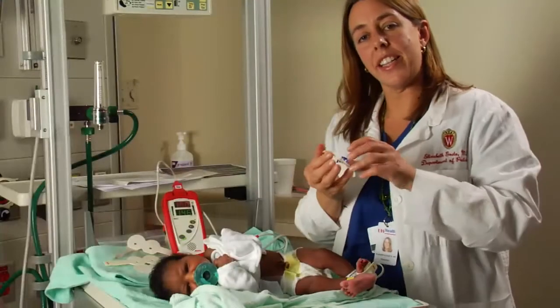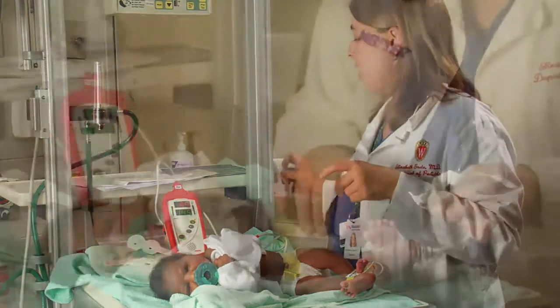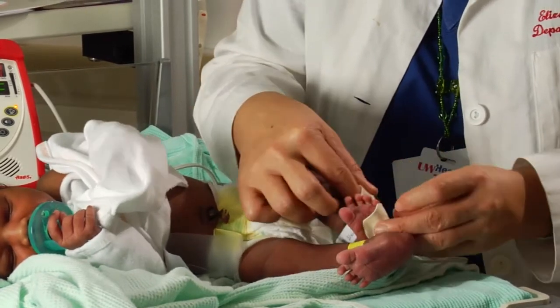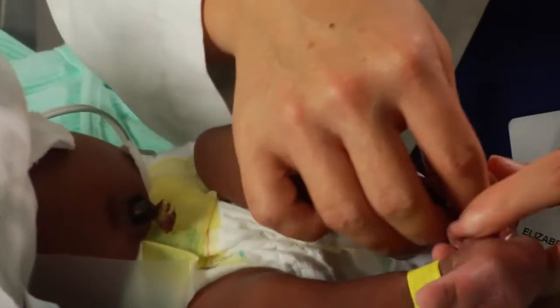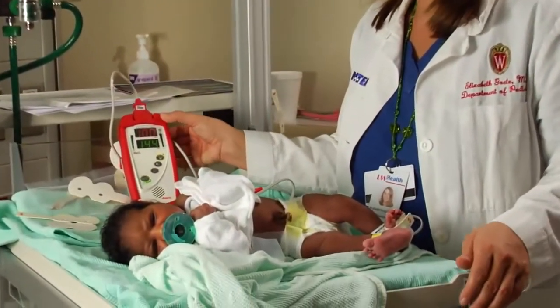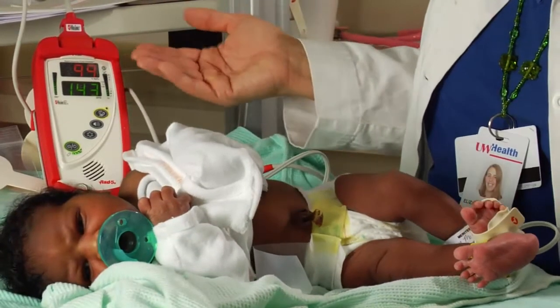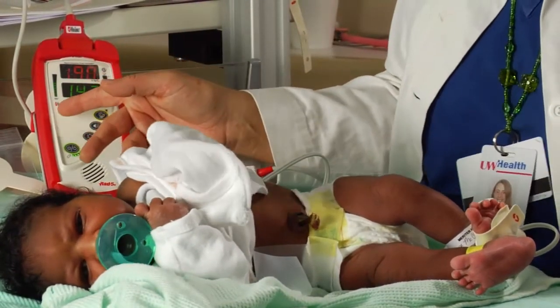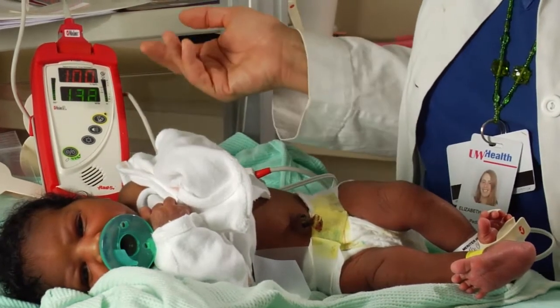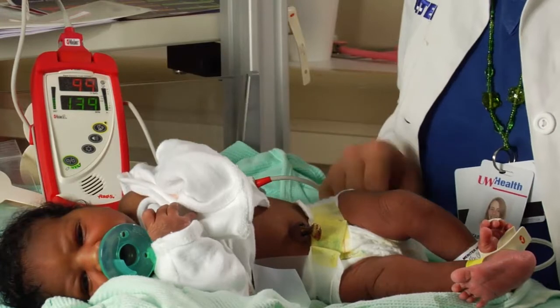I initially had a little difficulty with this probe going all the way around the baby's foot. So I switched over to a probe that had a little bit more adhesive backing and was able to get a pulse oximetry reading right away. Again, my pulse oximetry reading started around 78, but after a few minutes of waiting and making sure that there was good signal IQ and a good perfusion index, the pulse oximeter quickly read 100 with a heart rate of 134.